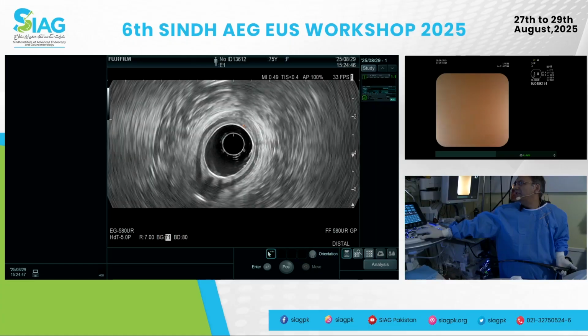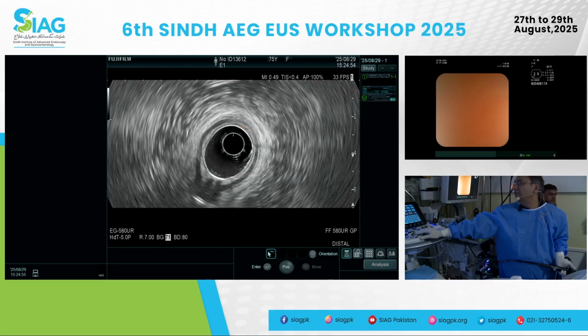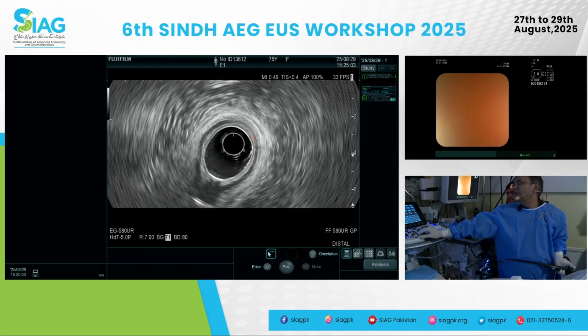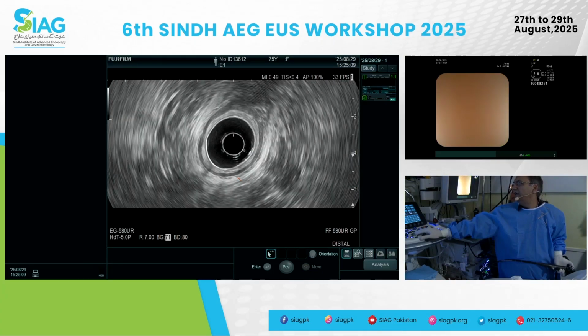Sometimes there could be a breakage in the internal sphincter on the top, and an episiotomy could also lead to some breakage. That would look like not a continuity of the muscle, but like a fibrous strand there and a breakage in the muscle. Overall, it looks pretty intact right there, so I think that sphincter is okay.